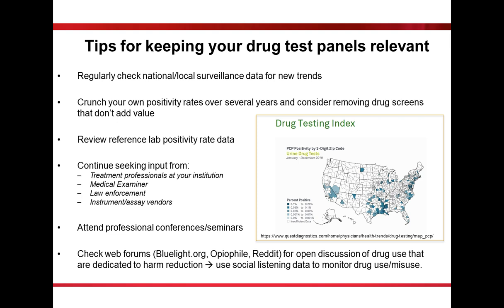I will tell you that we were playing around with the idea of removing PCP from our panel because we hadn't seen a positive PCP screen in a really long time. There were very, very few over a 3-year period. But after consulting with our clinical toxicologist and seeing information like this, which I'm showing here in the image to the right, there are actually small pockets in Ohio where PCP is still being abused. So it would not be smart for us to remove it from our panel.